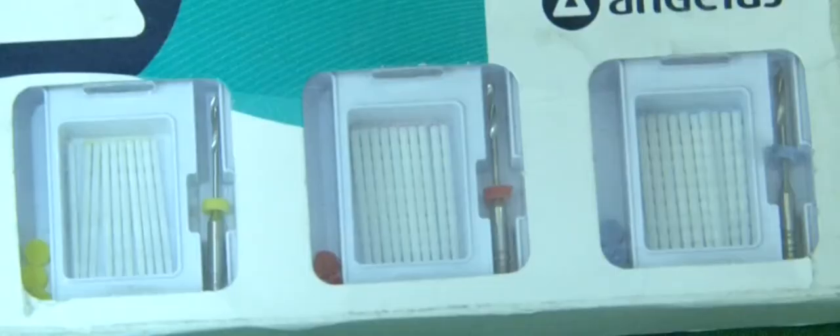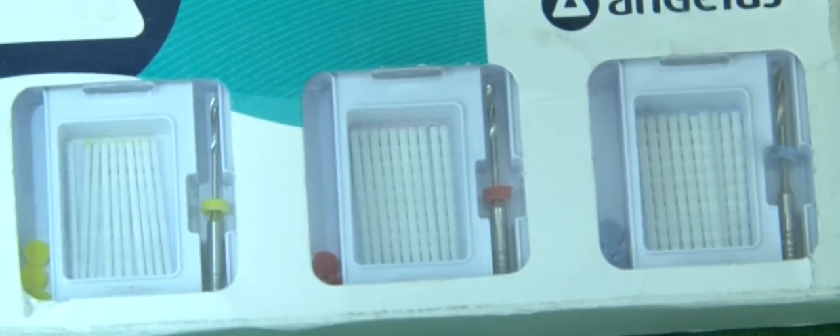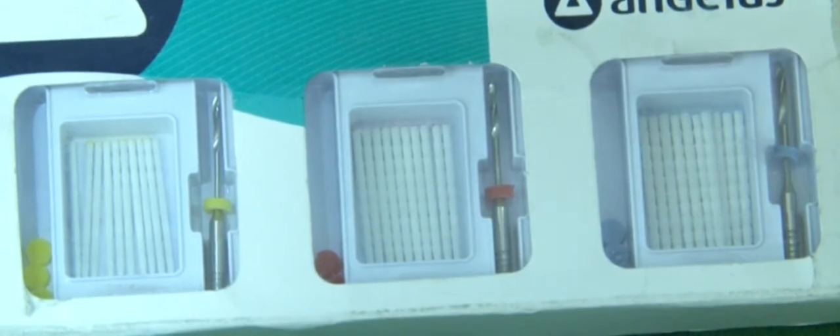This is a very important procedure because if GP is left in canal, it may be difficult to achieve appropriate bonding for teeth. We are going to use glass fiber reinforced post like Re4 Post by Dental Avenue. This kit of Re4 Post has a variety of sizes available with their respective final drill. In this case, we are using the number 2 fiber post.